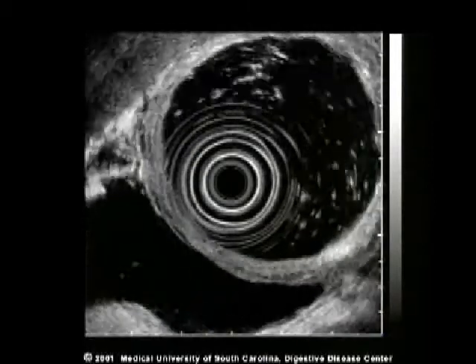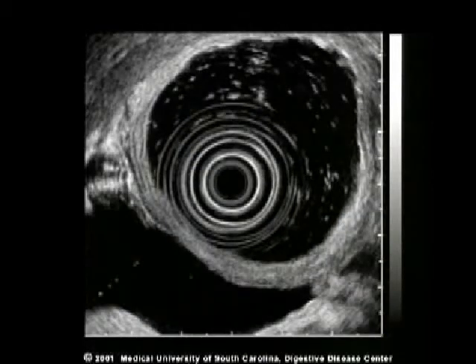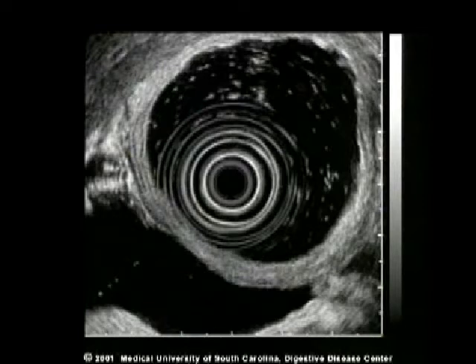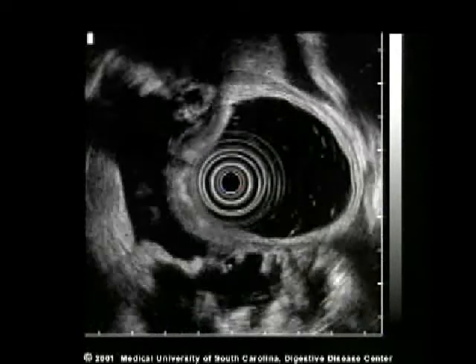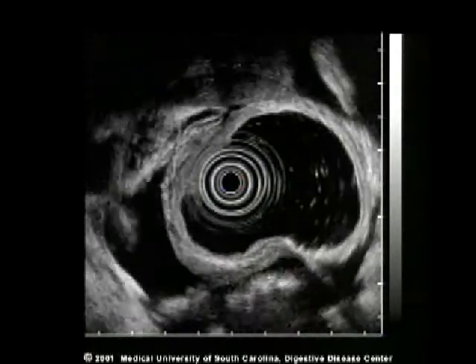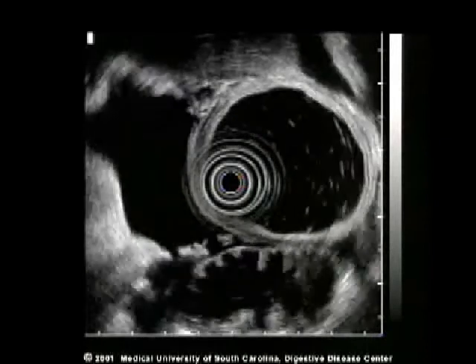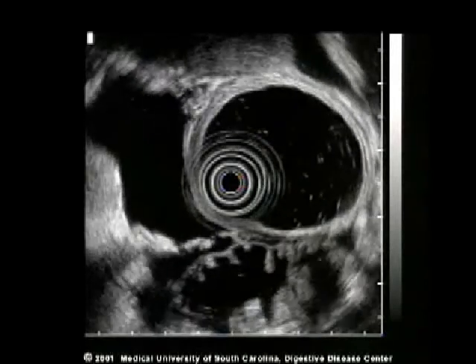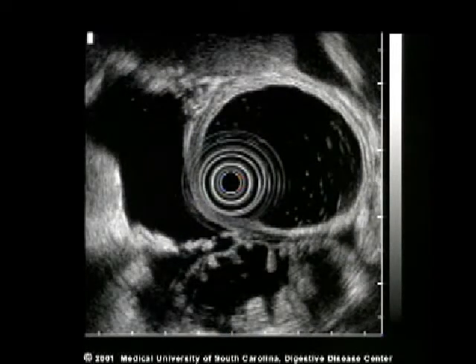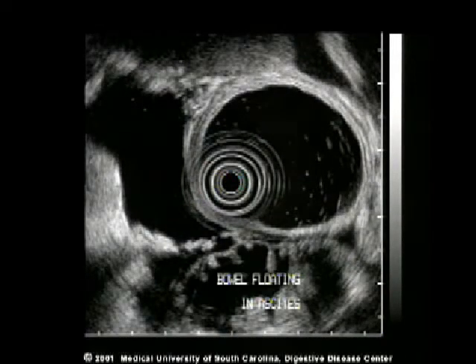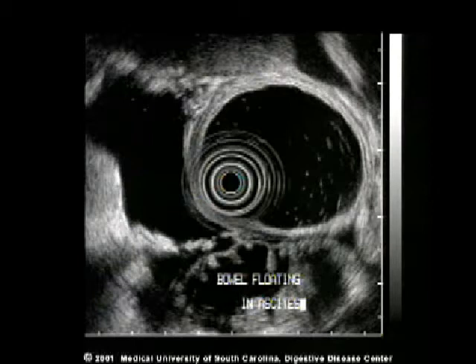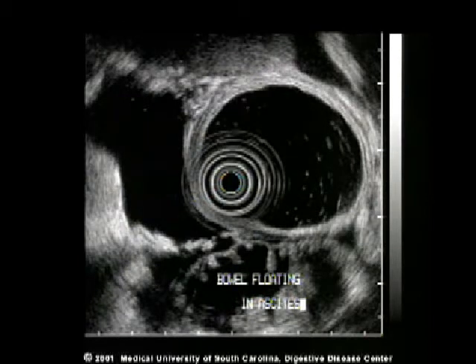The transducer is located within the stomach and a large pocket of fluid can be seen outside the gastric wall. Note the contours of this fluid are not well circumscribed as they are following the tissue planes within the peritoneum. There is also a loop of bowel seen floating within the ascites fluid.